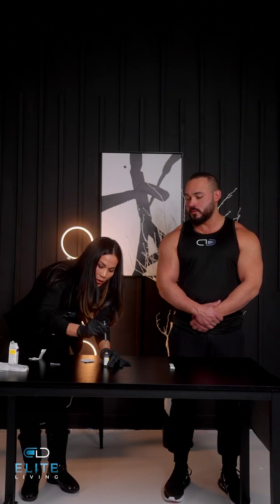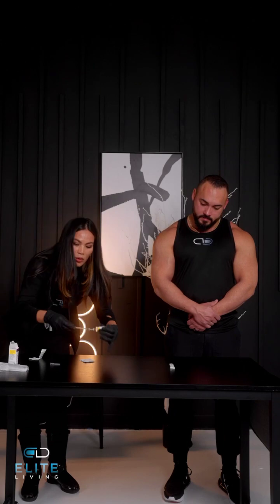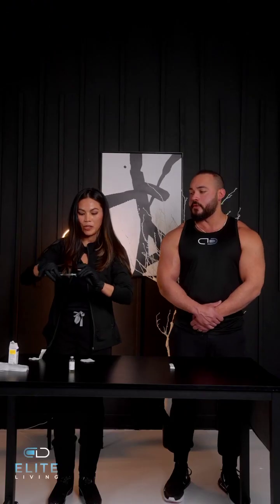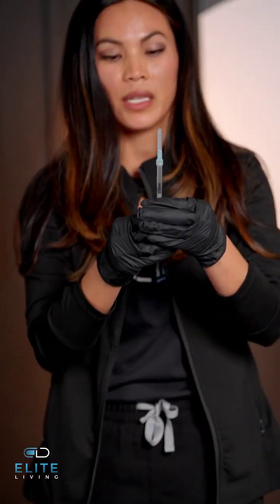Be careful when you go in to inject to draw out the medication — you don't want to poke yourself just yet. Be careful when you go back to recap. Remove that needle and apply the needle that you're going to use to administer or inject the medication.